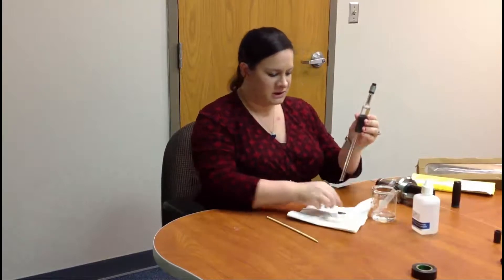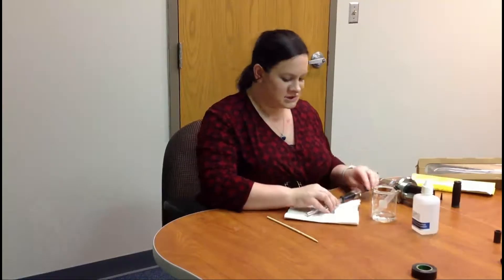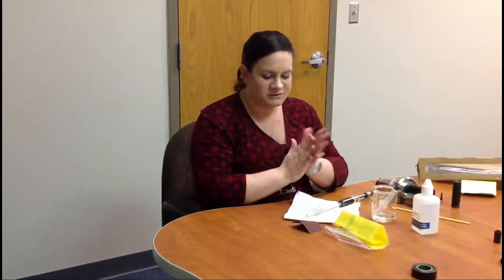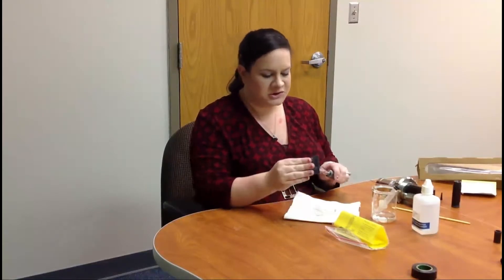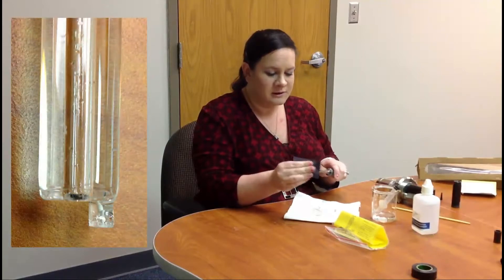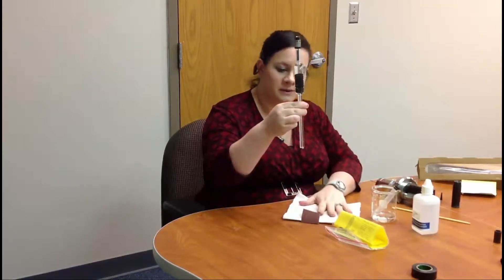There's one more item: sometimes the junction will get clogged and you'll need to re-sand it. In the box, there's a bag with an instruction sheet that includes a simple emery board — just like a nail file. At the very tip of the sensor is the junction. Simply take the emery board and sand the junction down. This re-opens the junction and gets the flow going again. That's how easy it is to maintain your Bell-O-Matic.